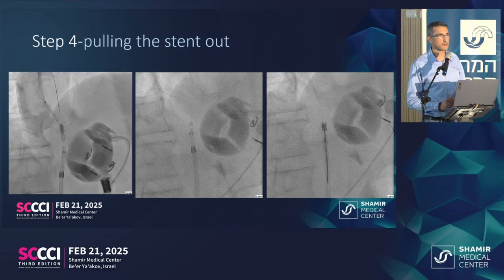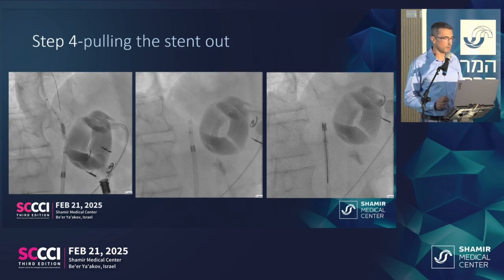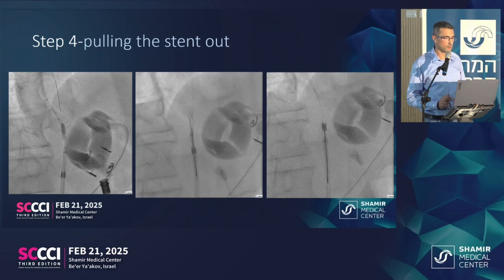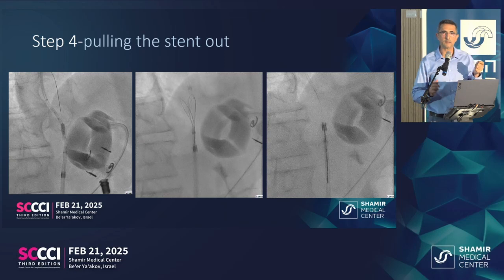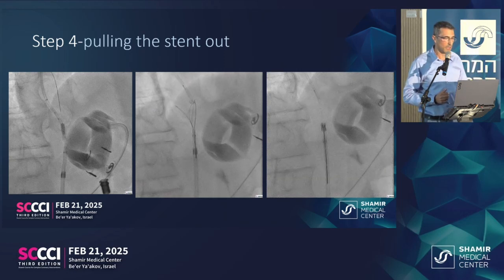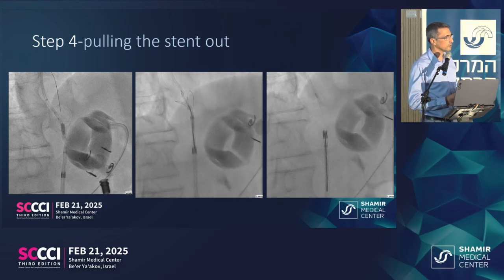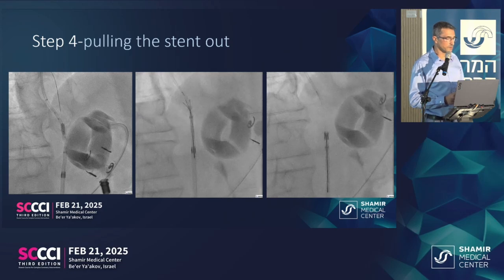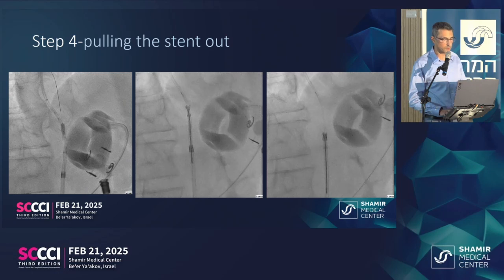After externalizing the wire, we had a secured stent on the wire. We were able to pass the EN snare, and you can see that the EN snare pushes the stent upwards. But again, the good thing about the EN snare is the ability to twist it. So you can work in a three-dimensional arena and eventually pull the whole thing towards the sheath. So the stent was crimped with the EN snare and was pulled backwards all the way to the sheath.